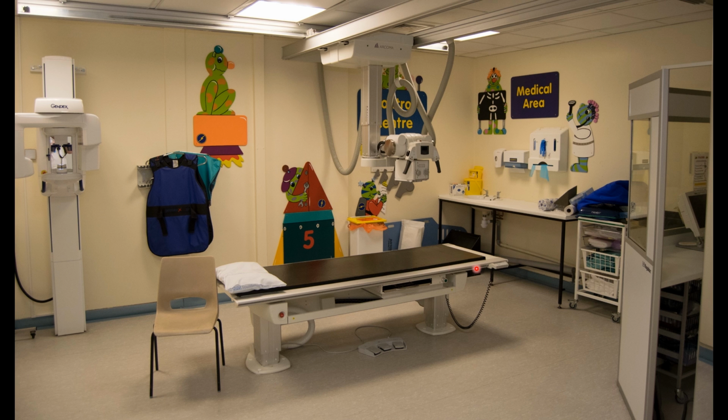And the grid is a kind of lattice of lead strips, and it moves to stop scatter radiation, but that's for another video. You can have moving, fixed, focus grids, various kinds of grids. Don't need to worry about those. This is just really an introduction to radiography.